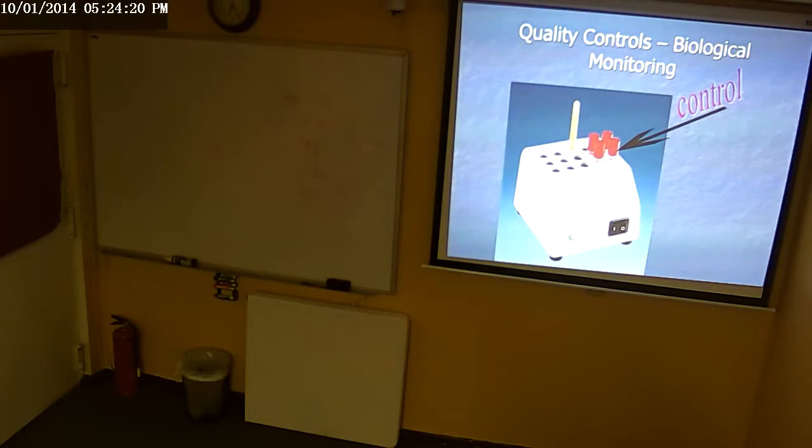If I take one from here and test it in another incubator and it works, then I'm suspecting the incubator is not working properly. But if it doesn't work in the next incubator, then chances are the organisms are already dead. I'm going to have to call the company and tell them, look, they all have serial numbers, this batch, this is what is going on. And the company will look at it and give you an answer.